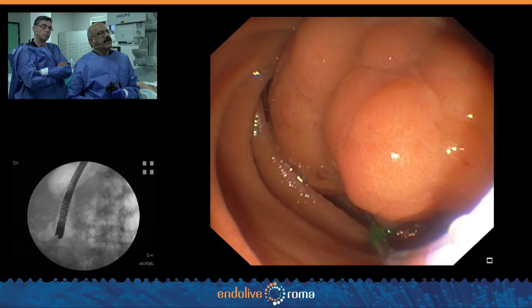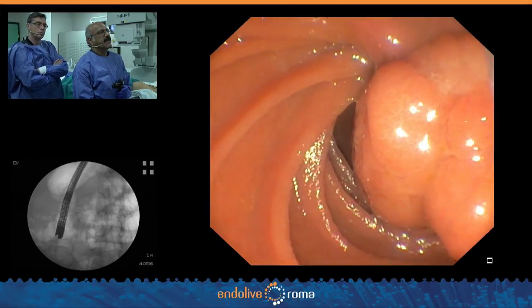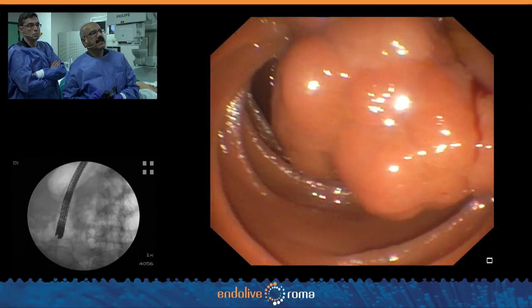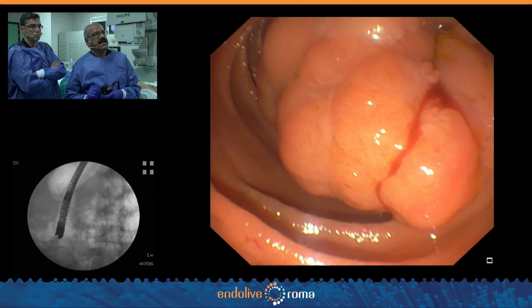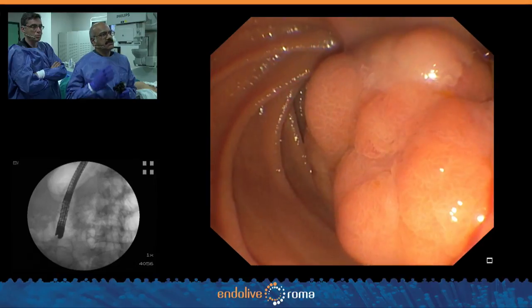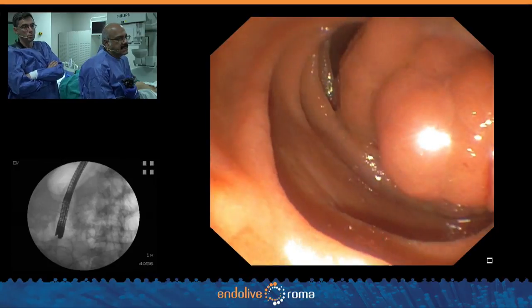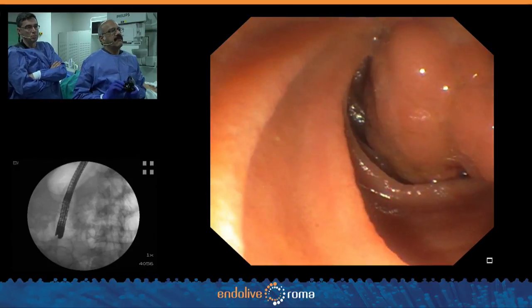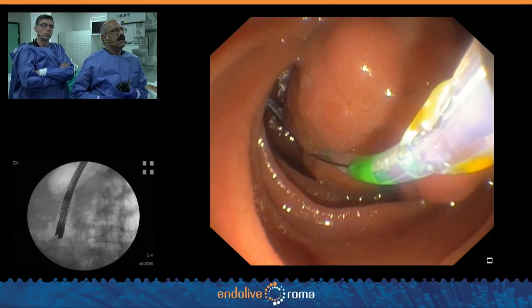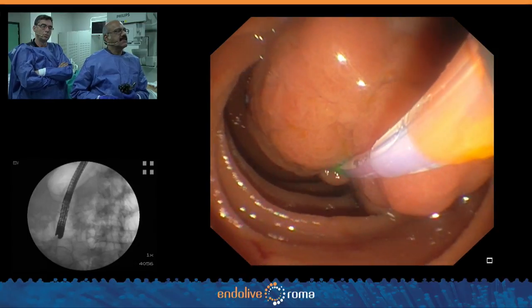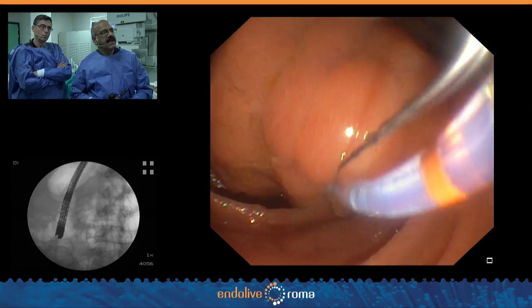If the lesion was laterally spreading, I would consider piecemeal resection. But in this case it's coming from a particular stalk, actually dragging it down. I need to carefully check around the lower end because I'm not sure exactly where it ends. I'll require a very long snare to get around this area — that's why I'm assessing the lower end to determine what type of snare to use.